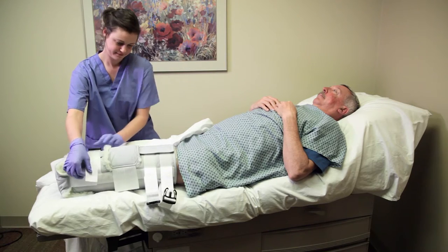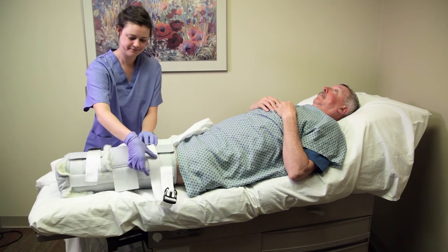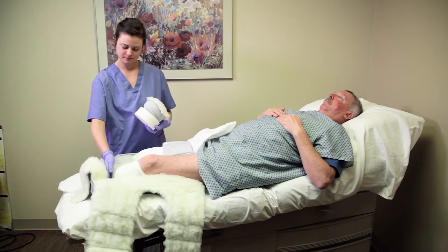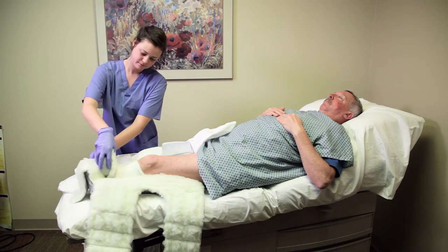The Rook BKA rigid dressing with soft interface is a universal fit. There is no right or left, and it is designed to fit most if not all patients despite leg girth or residual limb length.